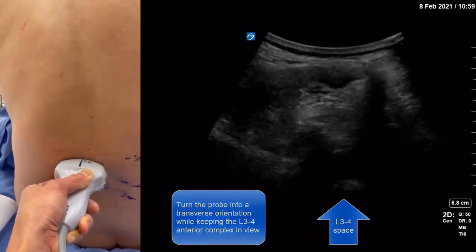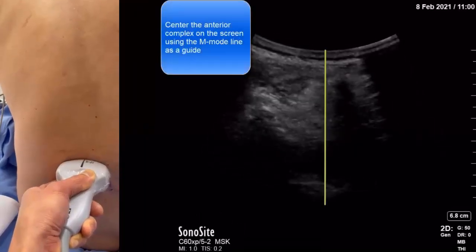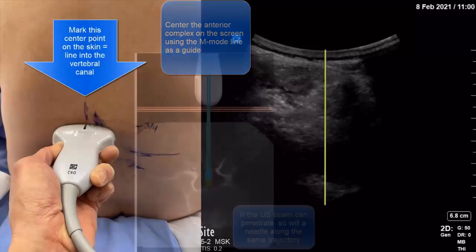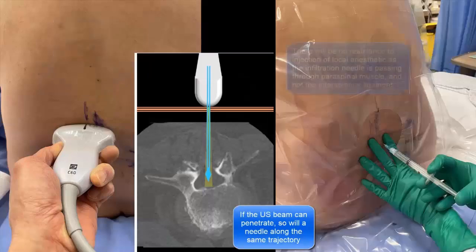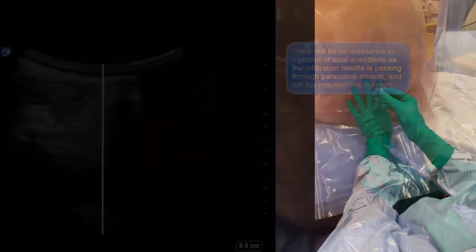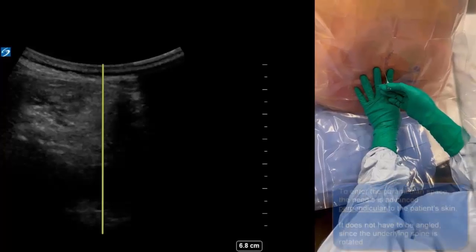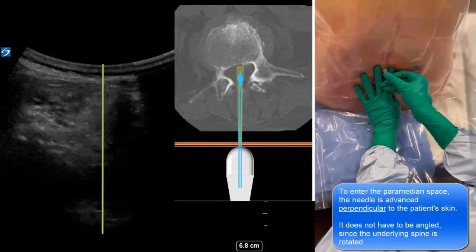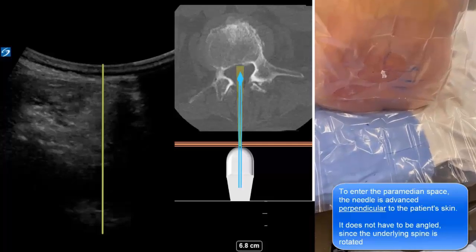Sliding the probe up to the L3-4 level, we can clearly see an anterior complex to the left of the spinous process shadow. We can center this anterior complex on the screen and mark its position on the skin. If the ultrasound beam can penetrate to image the anterior complex, then the needle will be able to follow the same trajectory to enter the vertebral canal. Local anesthetic infiltration should occur without any resistance as the needle is passing into paraspinal muscle and not the interspinous ligament. Because of the rotation of the spine, the needle can be inserted without any angulation to enter the vertebral canal using a paramedian approach.